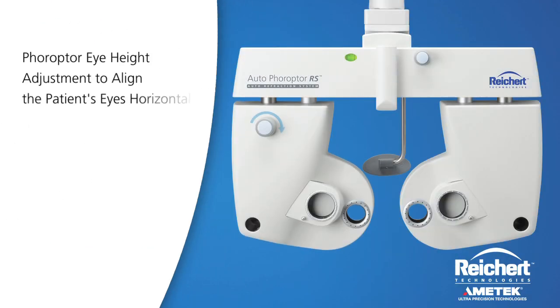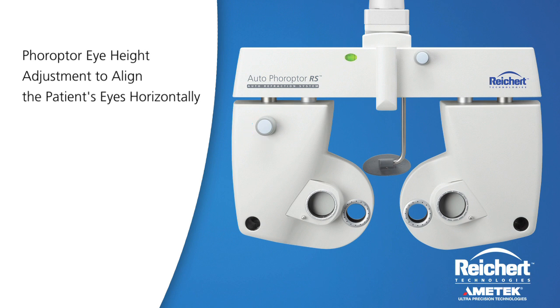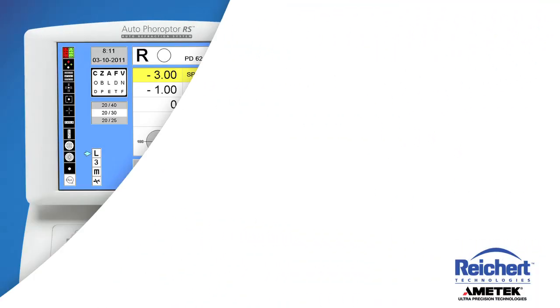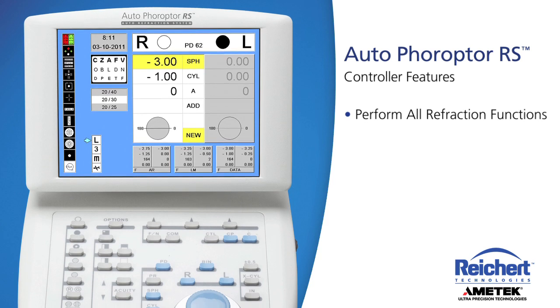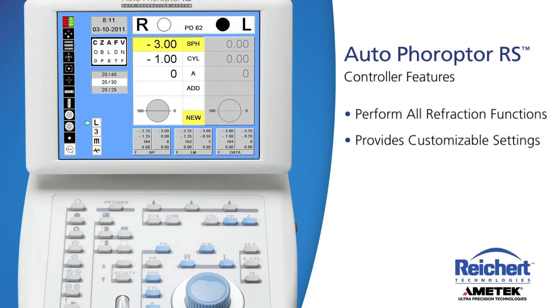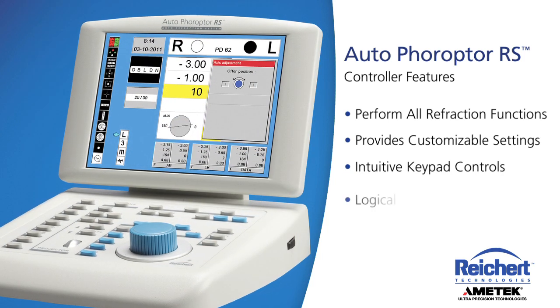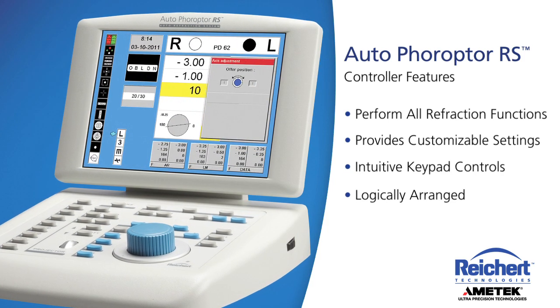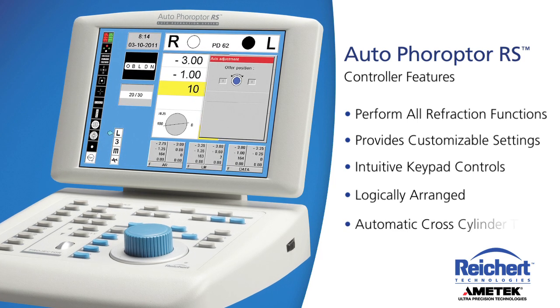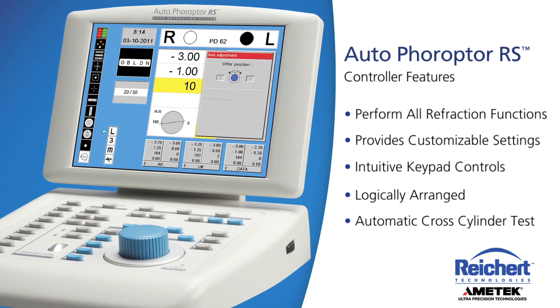Height adjustment on one side of the Phoropter allows you to align the patient's eyes horizontally. The Auto Phoropter's controller allows you to perform all refraction functions and provides customizable settings to meet your needs and preferences. The intuitive keypad controls are logically arranged and easily accessed. An integrated cross-cylinder test allows you to automatically refine the axis and cylinder.